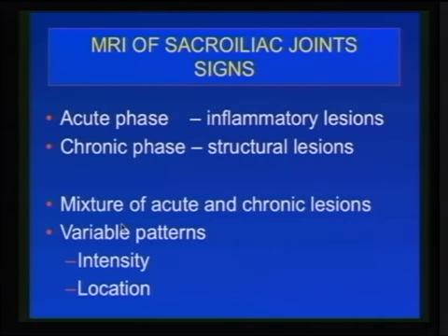The chronic stage is stage 3 of Modic, which is low signal intensity on T1, T2, and STIR images, with sclerosis. So that is the burnt out case. What we really need to do now is concentrate on the T1 weighted image for the structural damage.